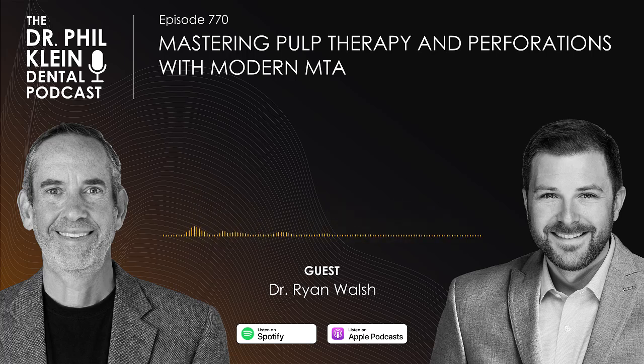Whereas calcium hydroxide, we know we're putting it in there as a paste, it's going to resorb over time. And that's the big advantage of MTA over the classic Dycal. That's still around today, and you still see these restorations with these little dark voids under them years later because it's washed out over time.